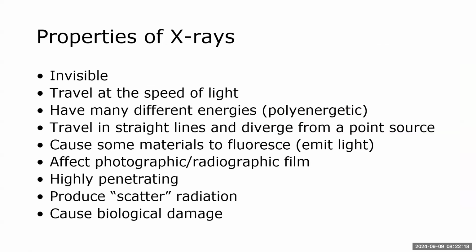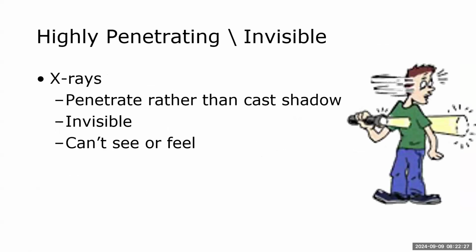So some properties of X-rays. They are invisible. We're going to actually look at each one of these specifically. So they are highly penetrating and invisible.